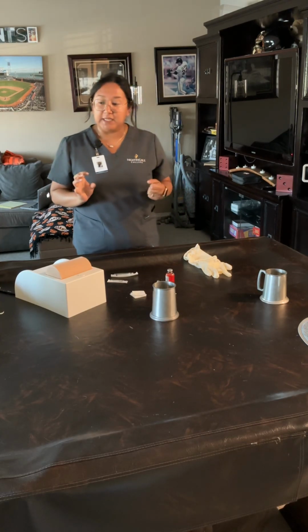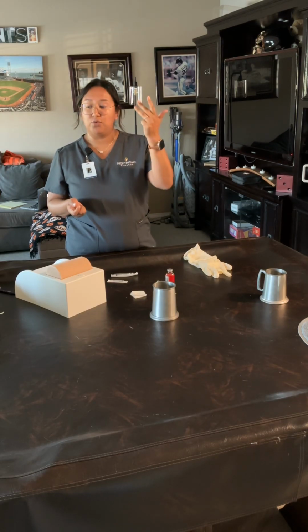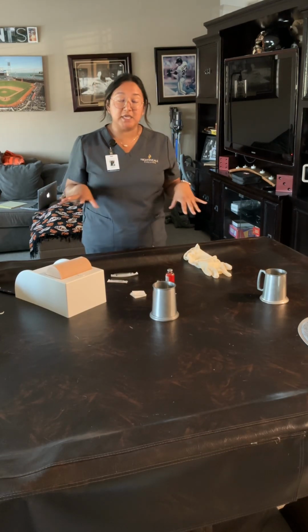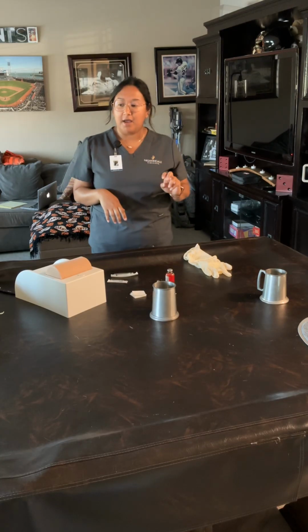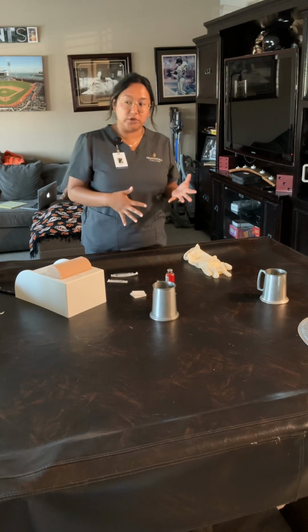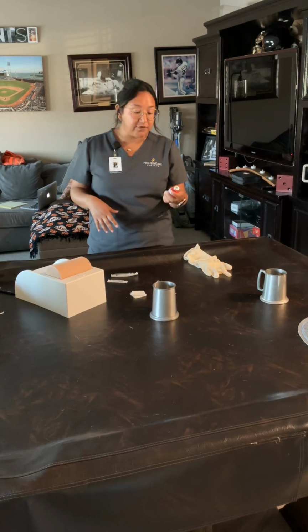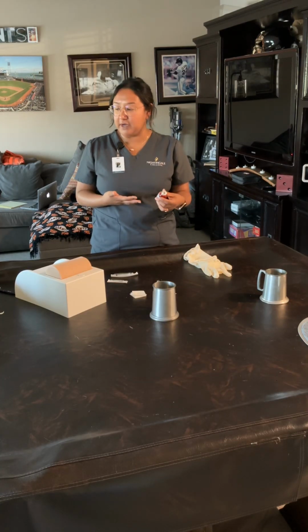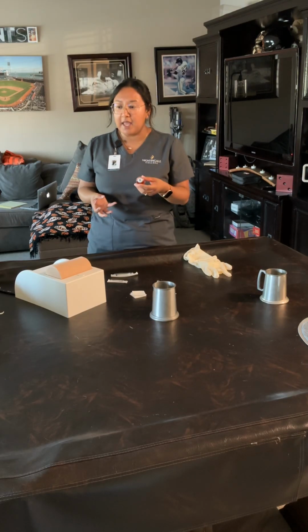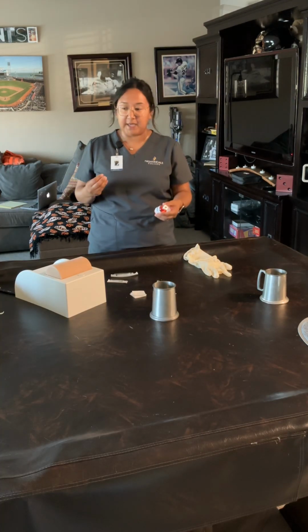So next I will go ahead and verify the 6 rights of medication, which is the right dose, time, patient, route, drug, and documentation. I'll verify everything in the EHR first before I get started, and the MAR and the dose with the patient or the doctor's orders. And then I'll make sure that it's morphine sulfate, because that's what the doctor has ordered. And right now I have morphine sulfate that says 4 milligrams per ml, and according to the doctor's orders, he wants 6 milligrams for pain.